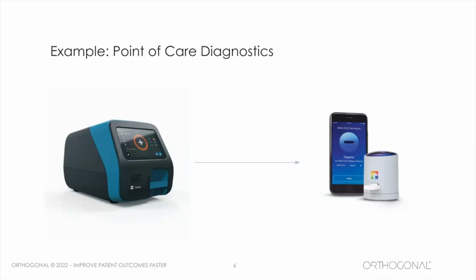It's got a data pipeline and an AI algorithm in the application. So it's a locked model, and that provides the outputs and then sends that data up to the cloud, and then from there on to the CDC. So the trend here is more of the smarts and the functionality moving from the device to the phone. And the difference in how much the device itself costs to produce and how quickly you can scale production is pretty dramatic.